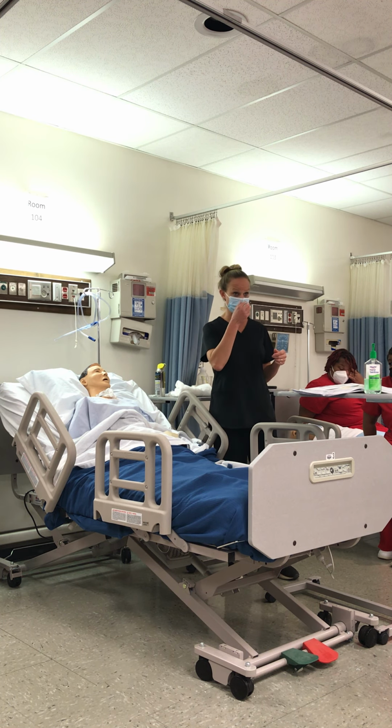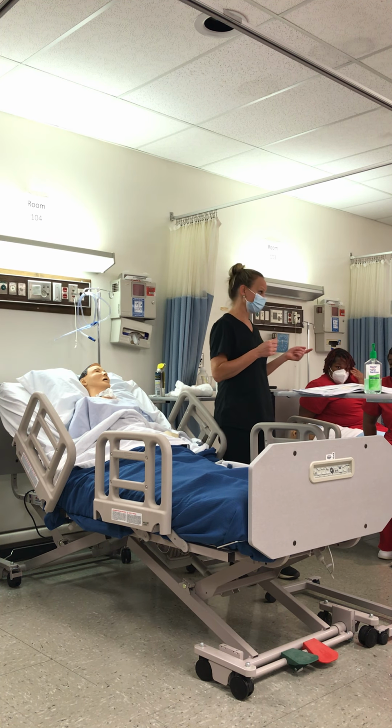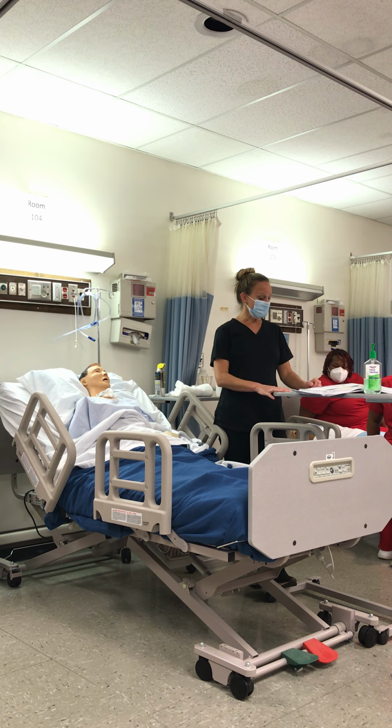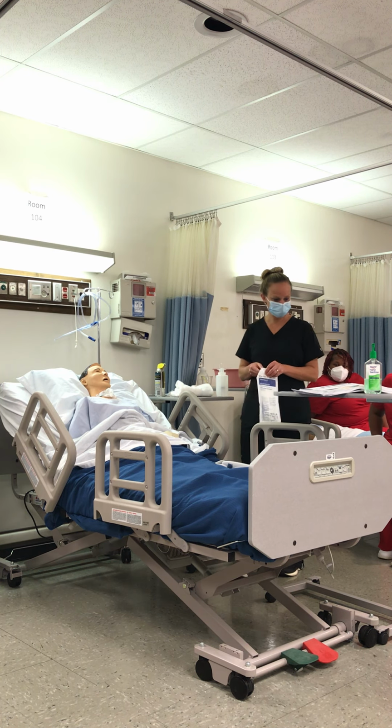It's going to be awkward for me. You always want to position yourself to where you're going to be able to take the best care of your patient as possible, whatever that may be. That's why you always need to make sure you have plenty of room to work, because you don't want to put yourself in an awkward position, either hurt yourself or not be able to do what you're planning to do because you're using the wrong hand.